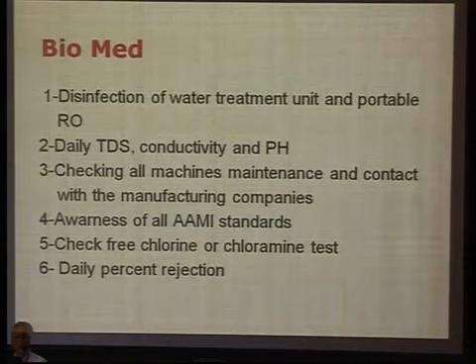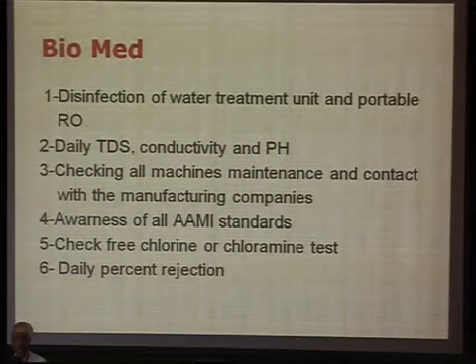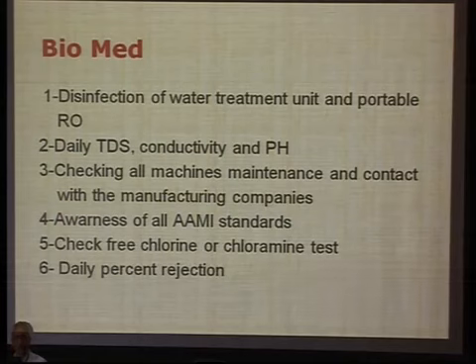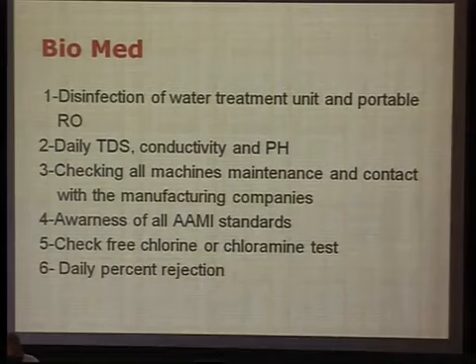Also, the role of biomed is very important in our teamwork regarding disinfection and the water treatment unit, regarding how to check the water treatment daily, monthly and yearly. It is very important for the biomed, for the quality of the machines and the quality of the treated water unit.